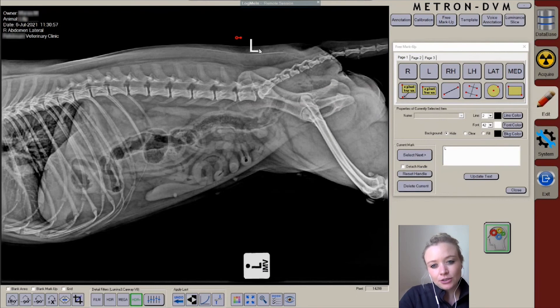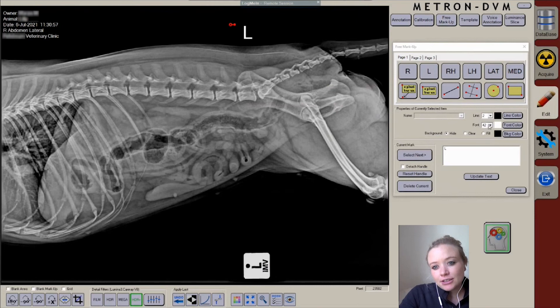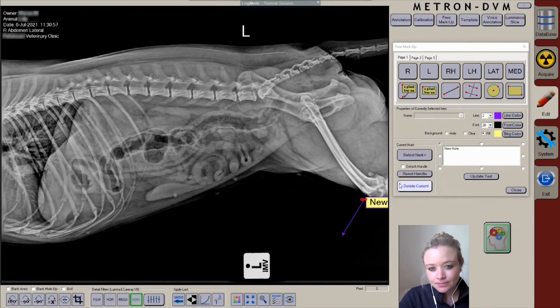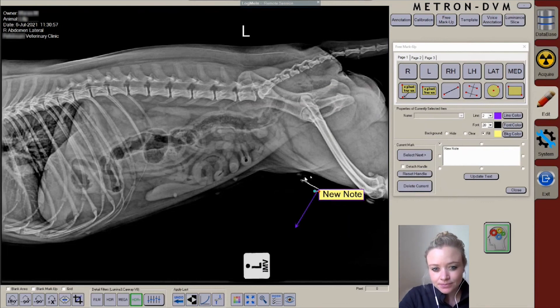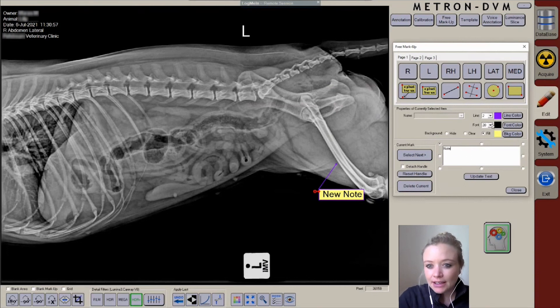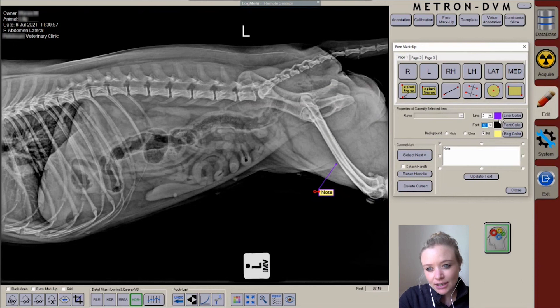Click on the left marker and click on your screen. You then have a little handle associated with that marker, which allows you to move it across the screen. You can also change the size of your font, the line size, and the line color if desired. You can add labels, which you can edit in the relevant box, and you are able to change the size of your label, the thickness of the line, and the line color.